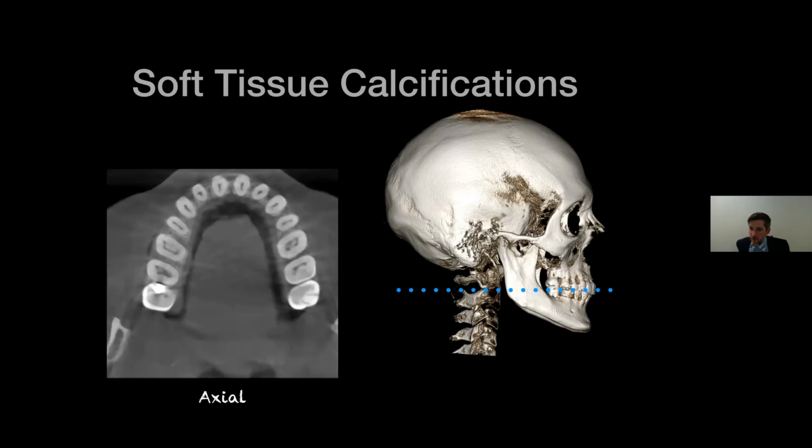Do you see advancements coming down the road with regards to AI in your specialty to make it easier for the dentist in the future? Yes, I do. And there might be some trepidation out there with dentists as it relates to radiology and AI. I think it's just another tool in the tool belt, and I think it'll become a really powerful option to help everyone. I think it's only a matter of time, and it's coming.